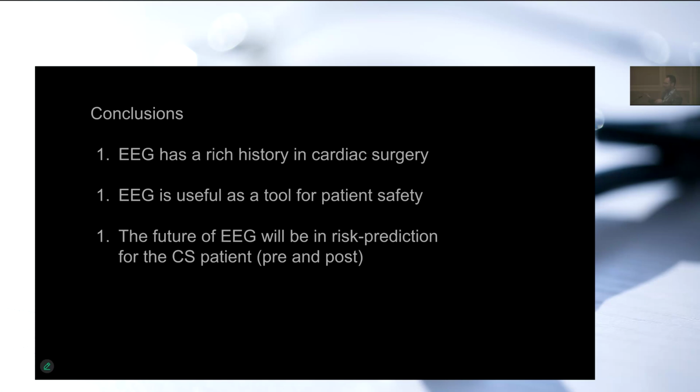They only address the energetic requirements for cellular synaptic activity. For the cellular metabolics, production of proteins, DNA repair, etc., none of that is affected at all by anesthetics. And so all of the heavy lifting of that cerebral protection will be done by hypothermia. So if you have isoelectricity in your EEG, there is no more value in adding additional anesthetic drugs. If you have burst suppression, then we can debate whether there's value in additionally getting that further.